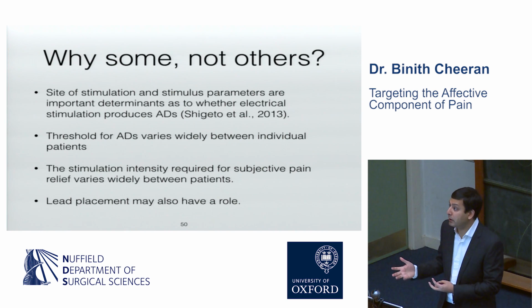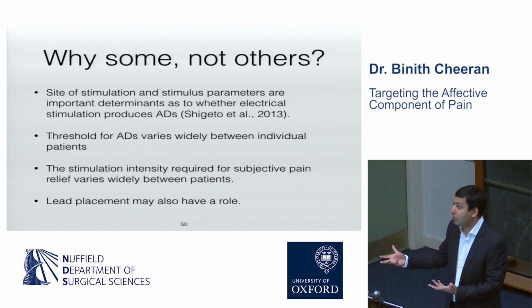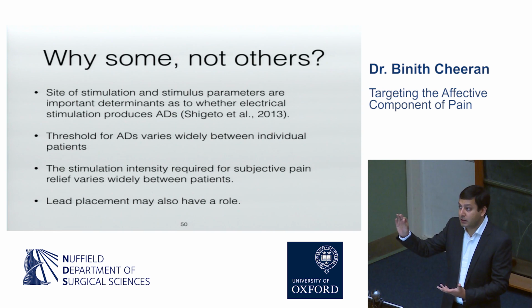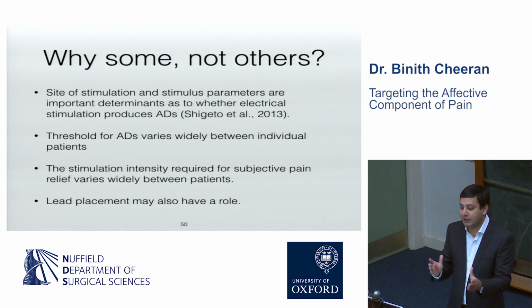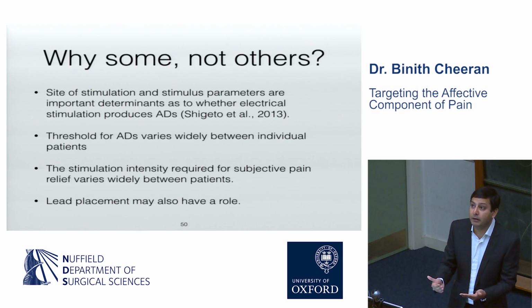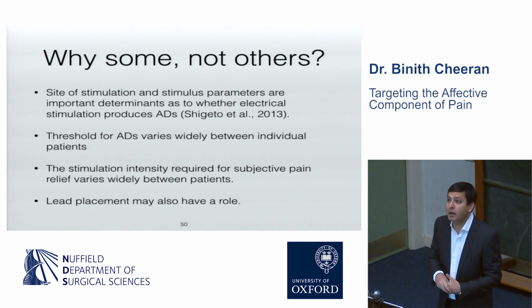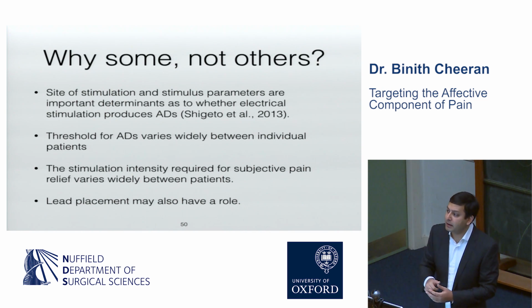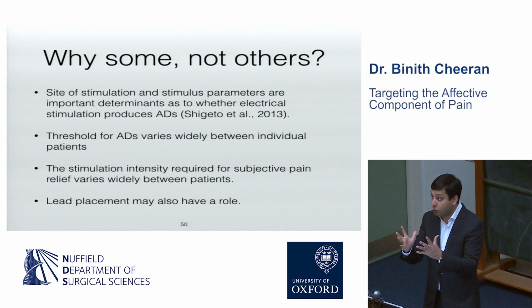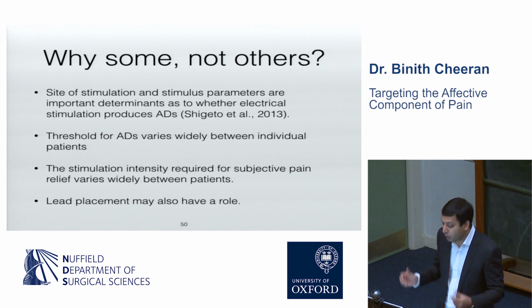And I think that's the really important thing, because when I program for movement disorders, I have objective signs to program to. I don't ask the patient how they're feeling. I look at bradykinesia, or I feel for rigidity, and I know objectively this is the setting they need, not the setting they want, but the setting they need. With pain, you're entirely dependent on subjective pain relief. And so you have to listen to the patient and tune to that patient's request, and that varies widely. Lead placement may also have a role, particularly deeper contacts, because if they're embedded in the corpus callosum, it projects strongly to the ACC in that area, and that might feed this kindling network.